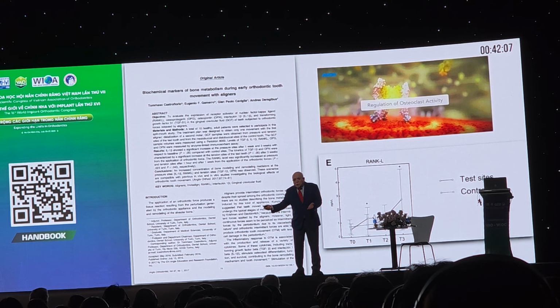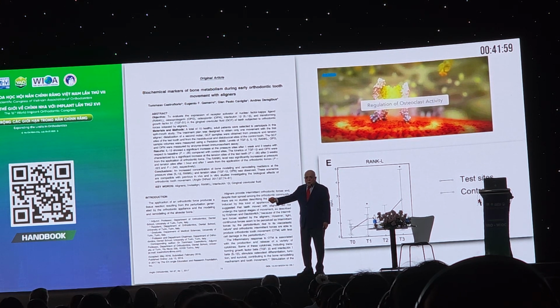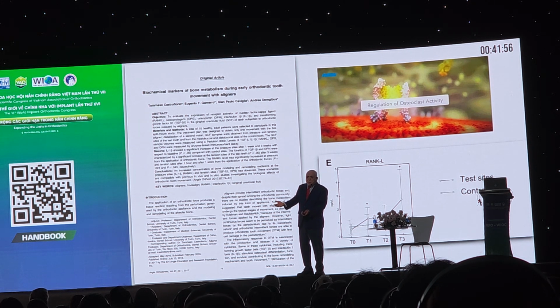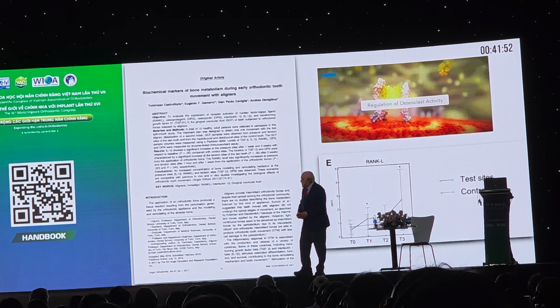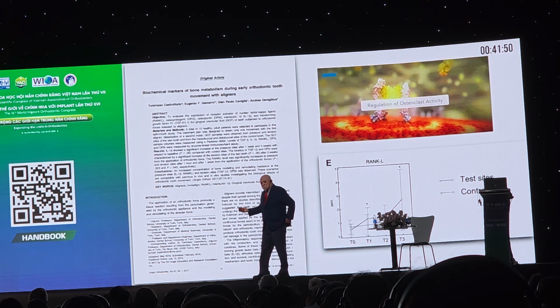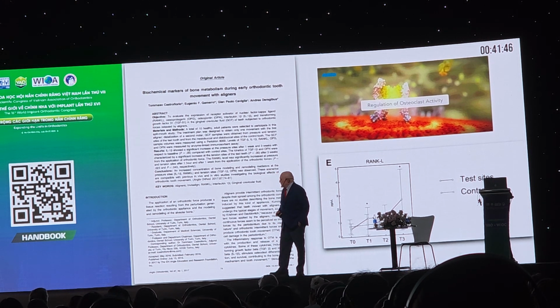And after 4 weeks, your teeth will start moving. So what do the companies do? Every time you give a aligner, 0.25, 0.25, by the time you reach the 4th week, you're already behind. Teeth haven't moved, you kept on activating, and the plastic gets deformed. The teeth are not moving. It's very important that we understand the biology of tooth movement.